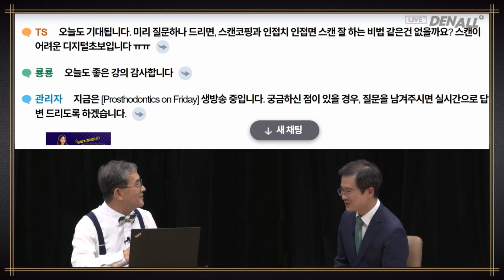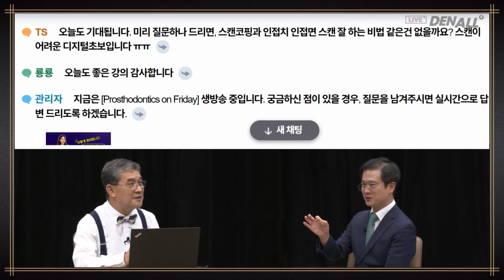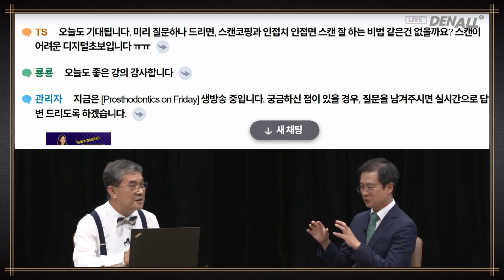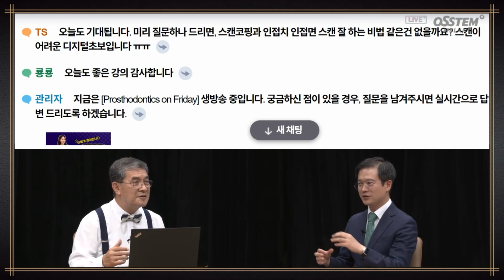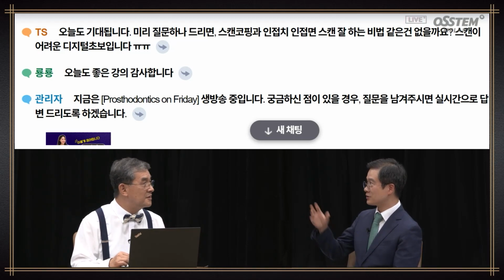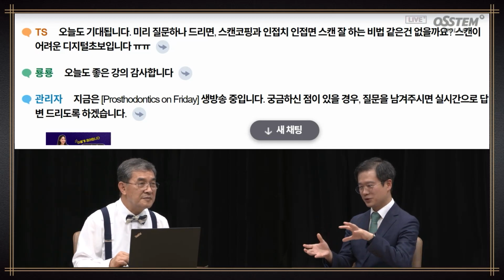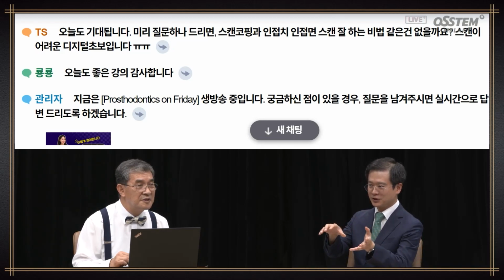Yes, it's a very practical question. From the top, the scan coping looks like a lone island, circular. From tooth to scan coping, it is recognized separately. At times, because of shiny surface, scanning is not done properly. In order to do scanning properly, you need to tilt it buccally or lingually, and in that way, you need to scan it so that the side of the scan body can be registered.